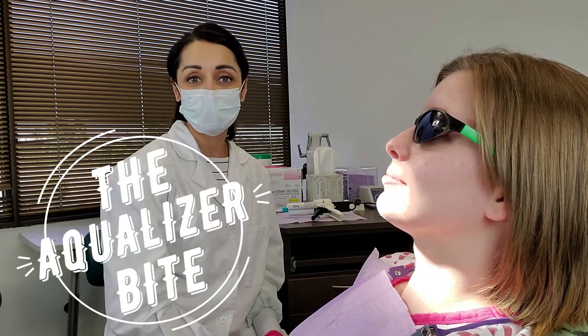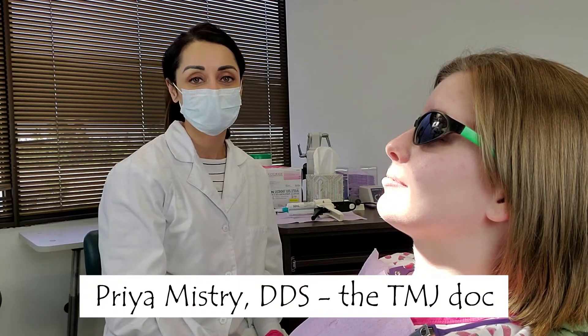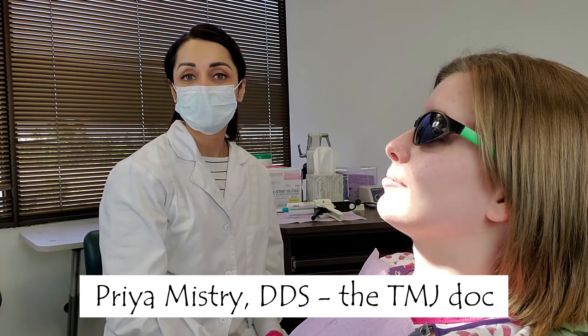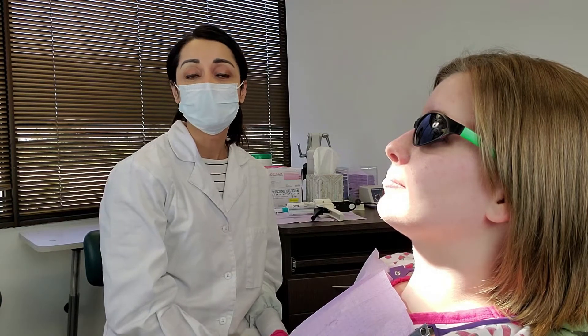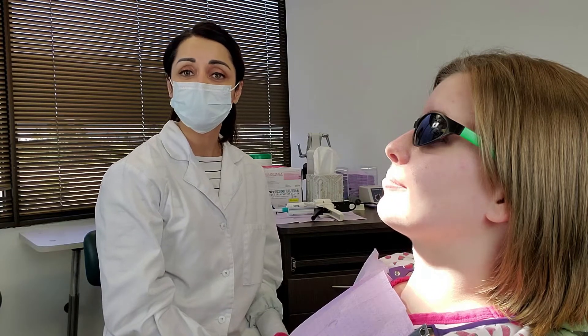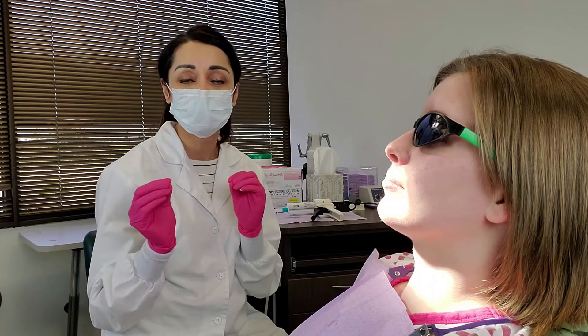Hi everyone and welcome back to my YouTube channel. My name is Priya Mistry and I'm a general dentist with a practice limited to taking care of patients with TMJ disorders. Today's video is about the Aqualizer Bite. This video is specifically for dentists, prosthodontists, and any other specialists in the dental industry that want to do this for their patients.